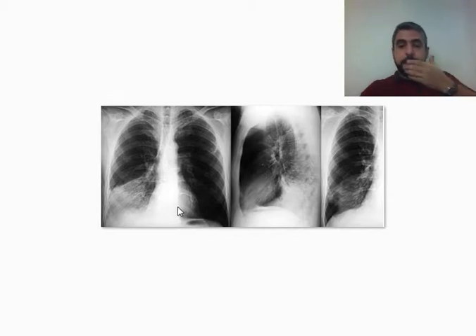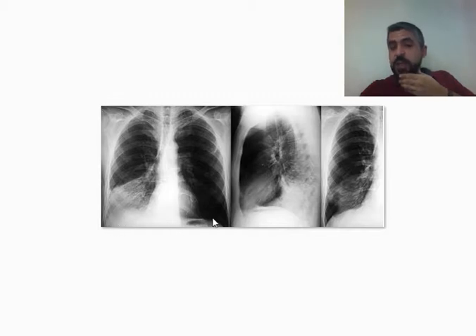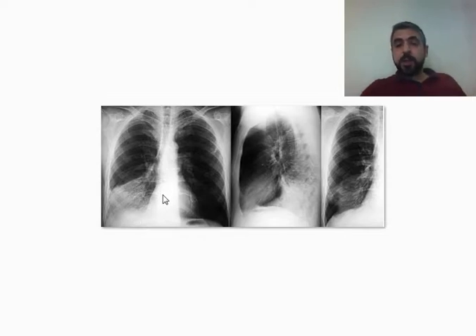Here we have another kind of consolidation. If you look carefully, you can see there is a fissure. The difference here is that the right side of the heart is quite obviously seen, while the diaphragm is not obviously seen. You cannot differentiate between the consolidated lobe and the diaphragm, but you can easily differentiate between the consolidated lobe and the right heart border. This indicates the lobe is in contact with the diaphragm — and the lobe in contact with the diaphragm but not the heart is the right lower lung lobe.